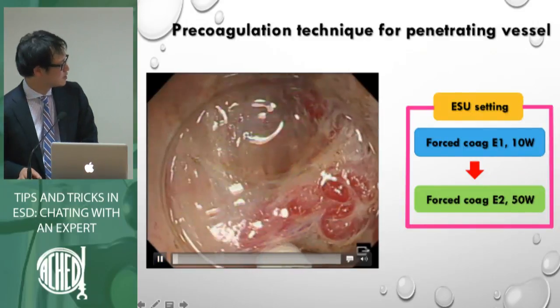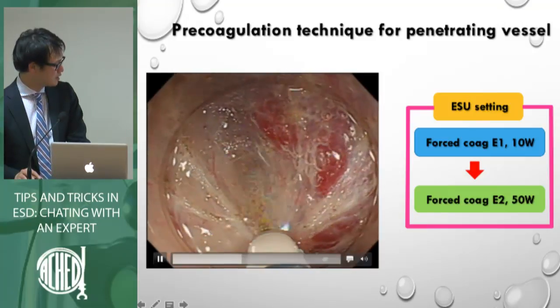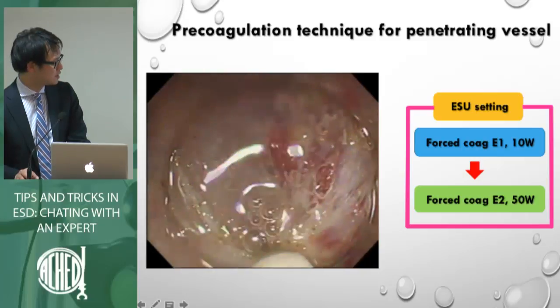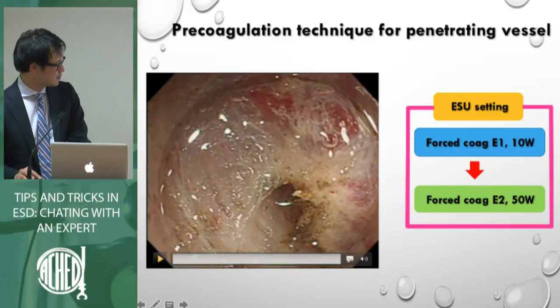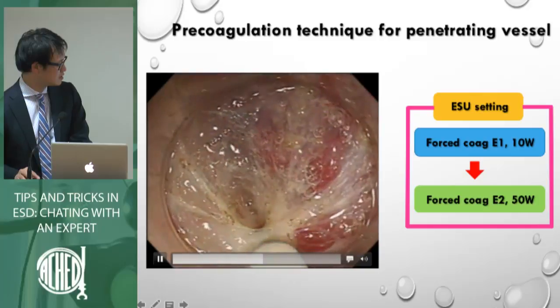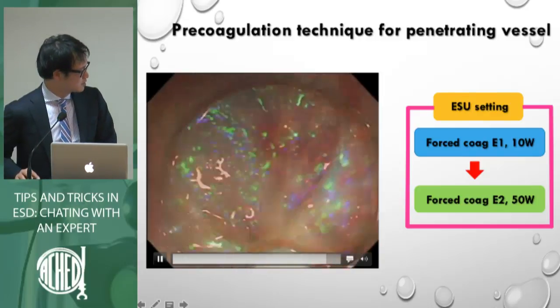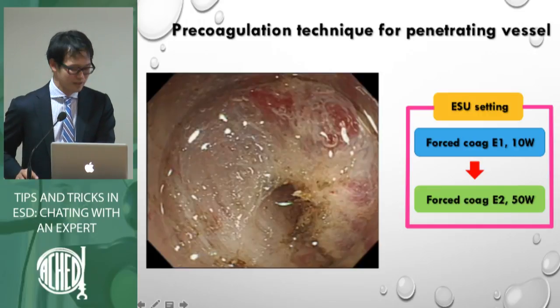So this is also our important method for preventing bleeding. For penetrating vessels, we are using forced coagulation, effect 1 and 10. If the vessels turn white, it's not bleeding. So when I cut these vessels, we use forced coagulation to avoid bleeding.